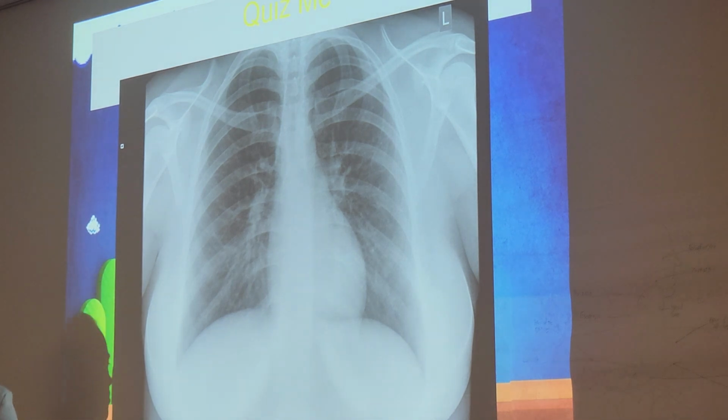And I want y'all to remember to write this down, guys, because I swear people still forget this because they see it differently in clinic. Per the curriculum, if your physical marker is not on that radiograph, you should repeat the x-ray. As impractical as that sounds, and I myself would not do that either because I'm not going to re-expose my patients. Per the curriculum, though, they expect you to repeat it with an actual physical marker. These digital markers are a legal issue that you should not find yourself in if there's ever a court case involved with that radiograph.